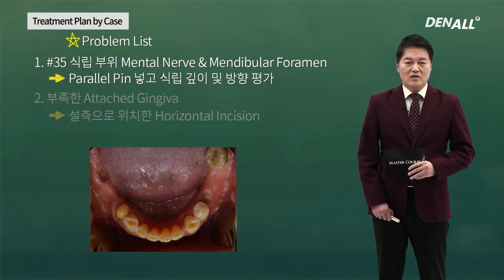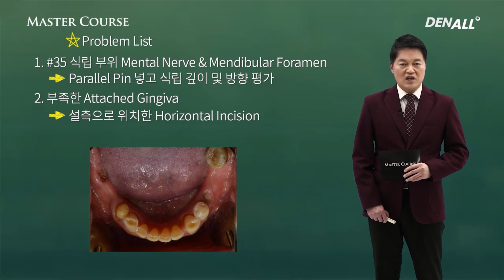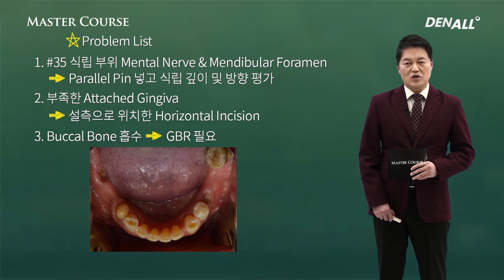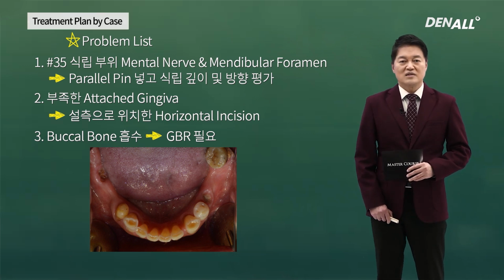Needs to be evaluated. Attached gingiva is lacking because it has been missing for a long time. Horizontal incision, slightly lingual, needs to be made. Because buccal bone has been rather resorbed, GBR process for restoration is necessary.